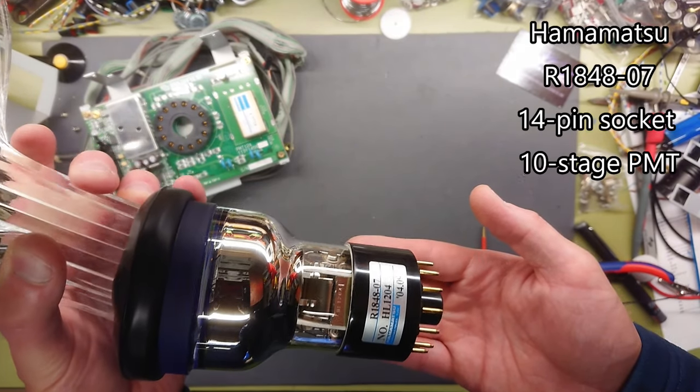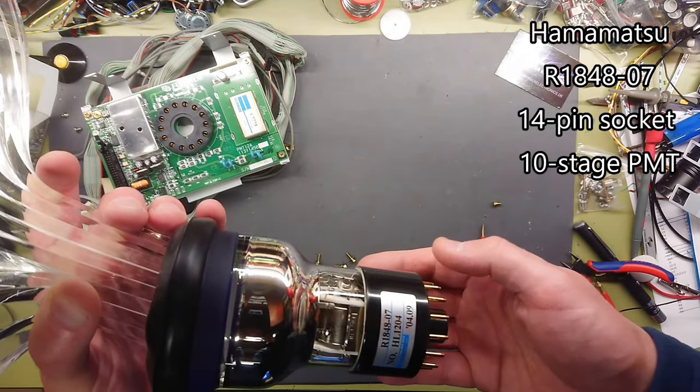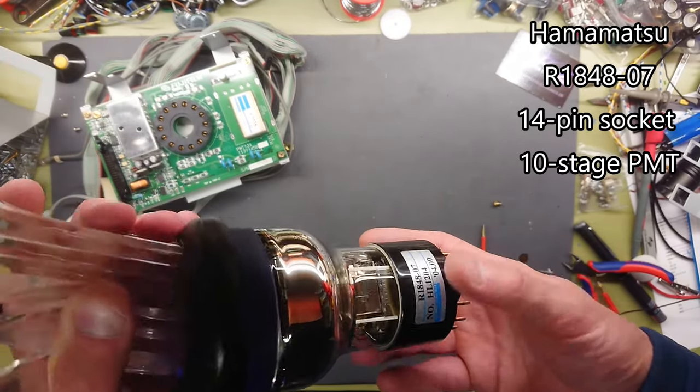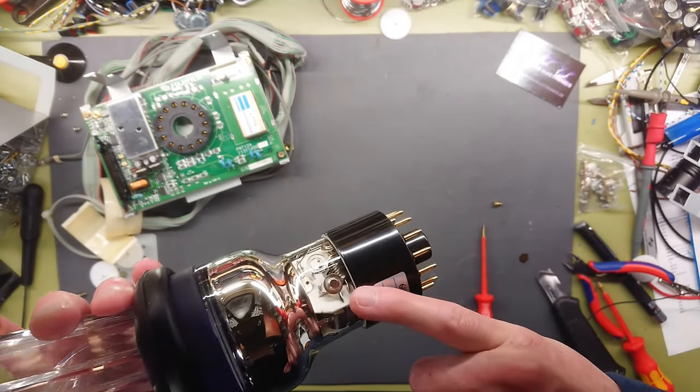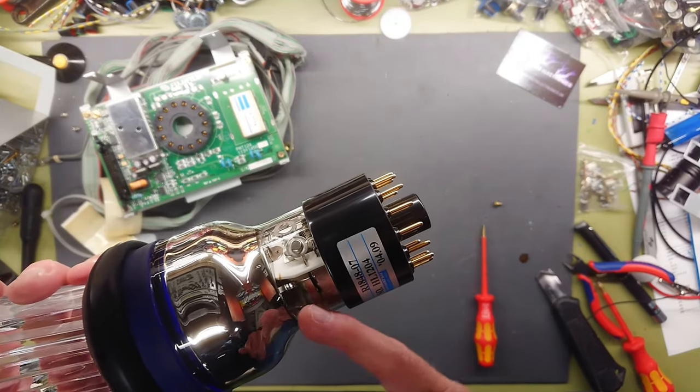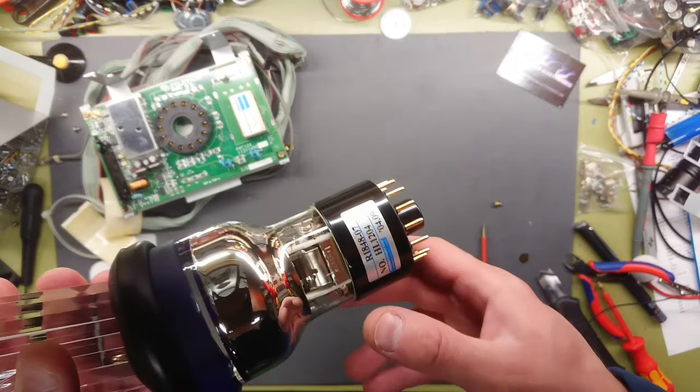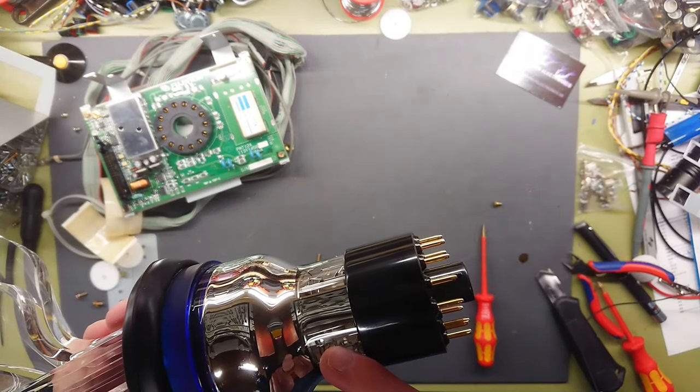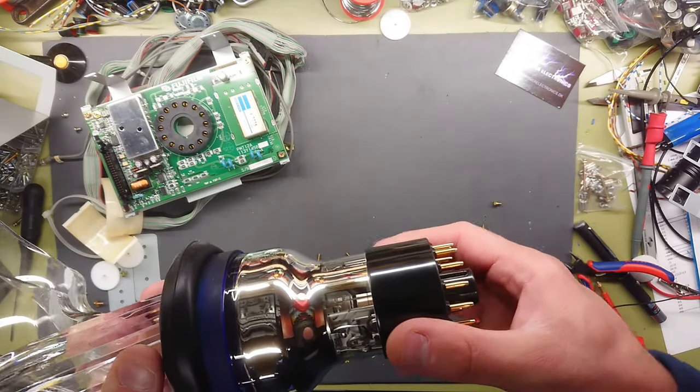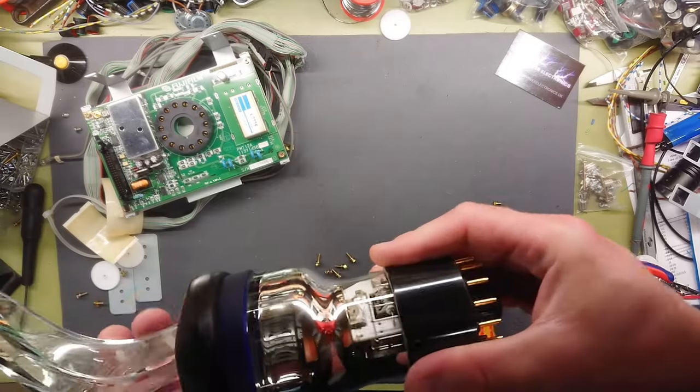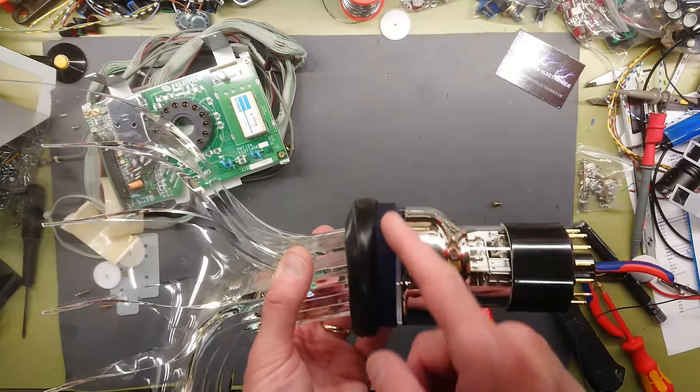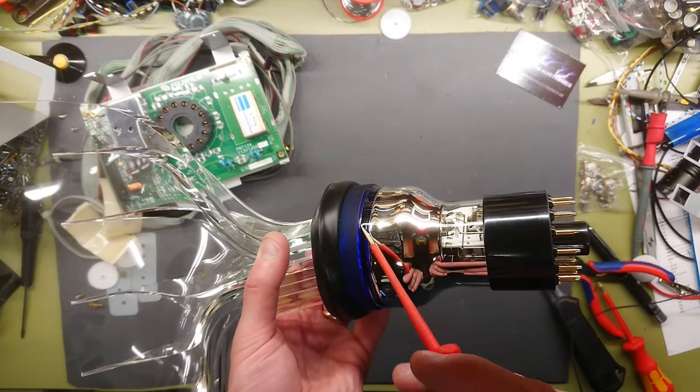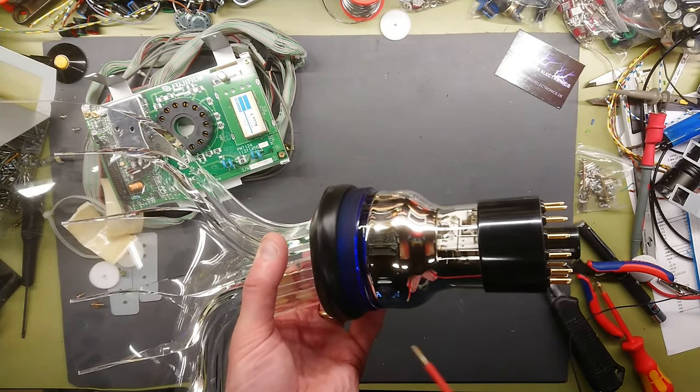A very nice Hamamatsu R184807 PMT. It's a 10-stage photomultiplier tube with a box and grid construction. We can see the curved box at the end and the back of the previous stage just below. A little hard to see with all the shine back into the mirror finish, but it is secured or glued on with some very heavy glue. The glass surface has another glass disc.